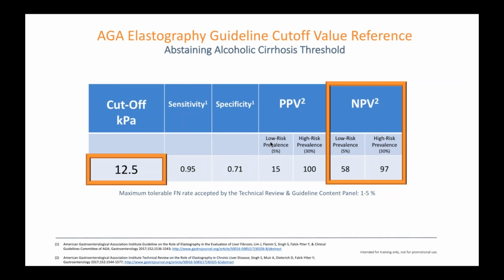And then to piggyback right off of that, how long do you abstain from before you can use the value specified in the threshold? Typically, that time period is in the range of 6 weeks to bring down that inflammatory influence of the alcohol.